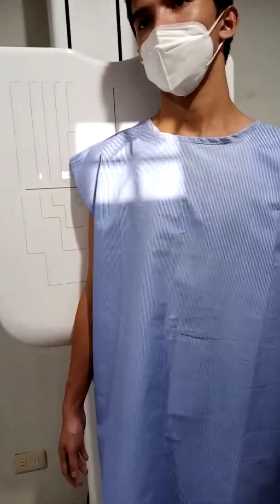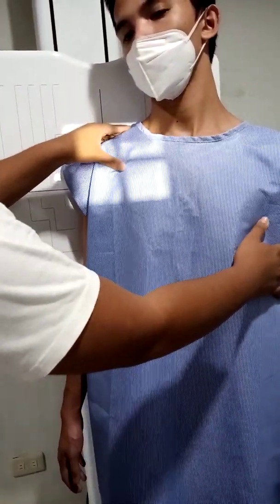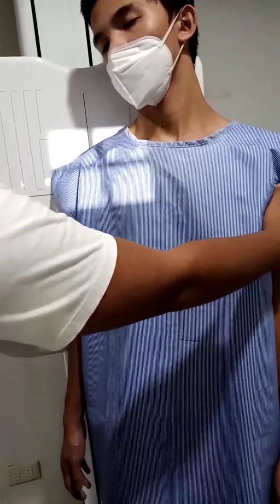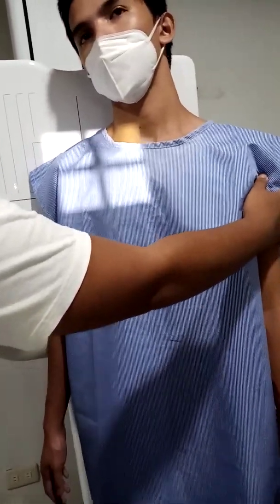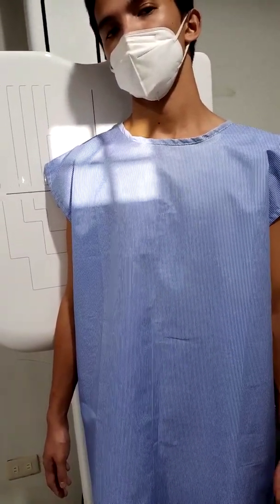Let me check. Do not move, sir. Center the IR, the central ray.